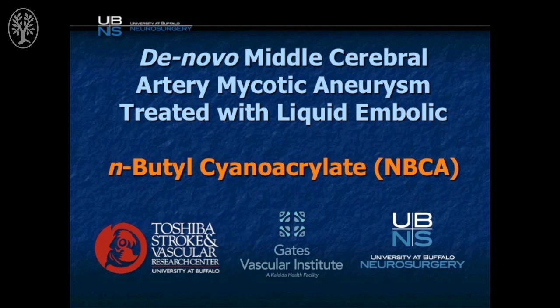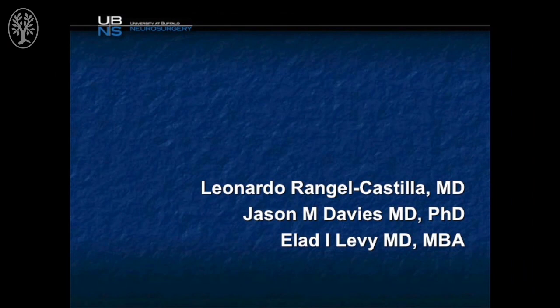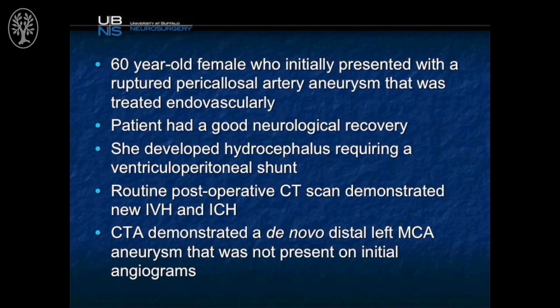This next case reviews treatment of a mycotic cerebral aneurysm treated with a liquid embolic agent, specifically NBCA. Here, a 60-year-old female who initially presented with a ruptured pericallosal artery aneurysm that was treated endovascularly comes in with a postoperative CT scan demonstrating new intraventricular hemorrhage and intracerebral hemorrhage.